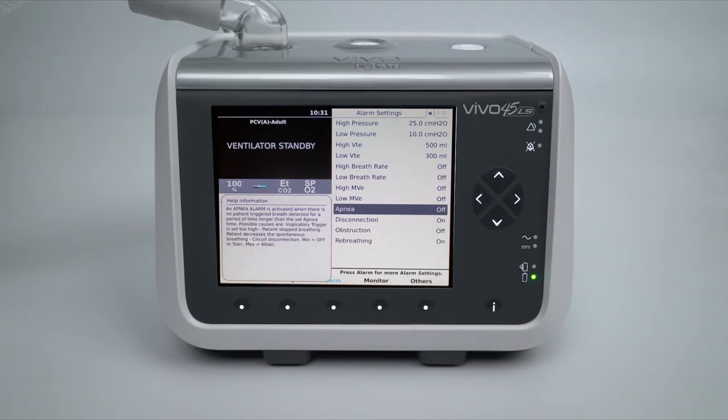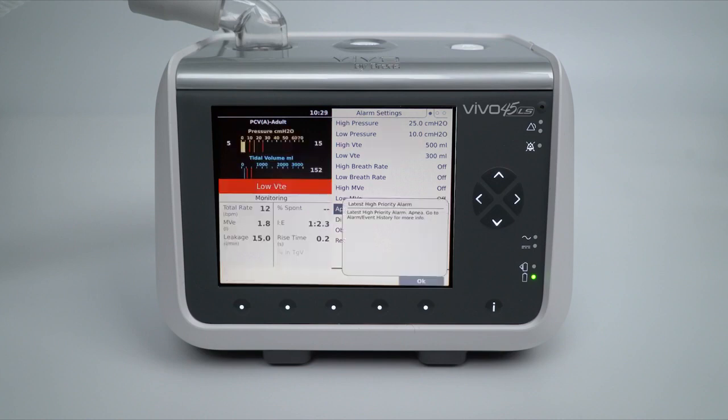If the patient returns spontaneous effort, the alarm will automatically reset. The alarm will re-trigger should the Vivo 45 LS again not recognise spontaneous breathing effort from the set time by the alarm setting. Once the alarm has been triggered the first time, a message will appear to notify the user. This message will persist even if the alarm resets itself.